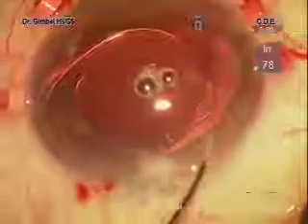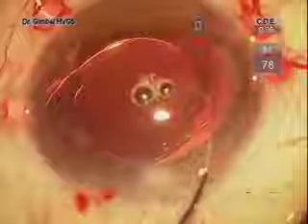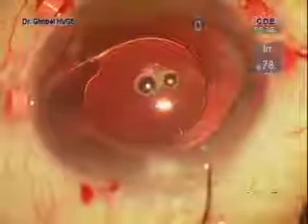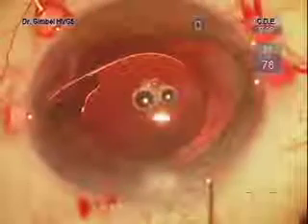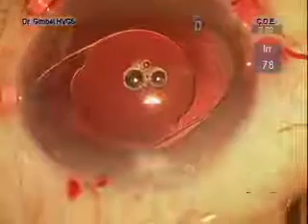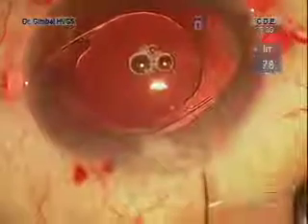You can see how resistant that membrane is to tearing, even with that deviation of the needle as it was pulled out of the incision — it still did not tear the membrane. With the Sinski hook, we are pulling the loop of the suture out of the incision, but not the entire suture, to use the Sipser knot tying technique.